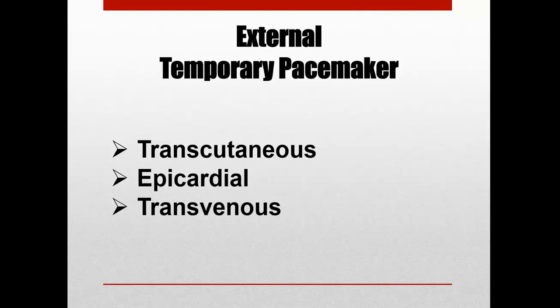It's also important for us to note that before permanent pacemaker insertions are even considered, we have to be sure that the problem cannot be resolved through medical treatment. If it's something we can fix with a med and the patient's good, then we're okay. But if it's something that truly needs a pacemaker and can't be fixed medically otherwise, then obviously we have to do what is necessary.